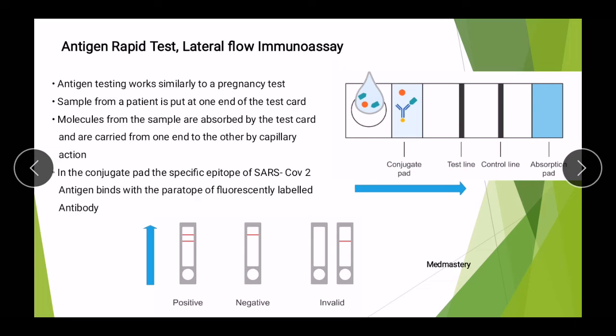Now moving on to the next slide, where we'll go deep into the mechanism, like what is inside the conjugate pad, what is inside the test line, and what is inside the control line.